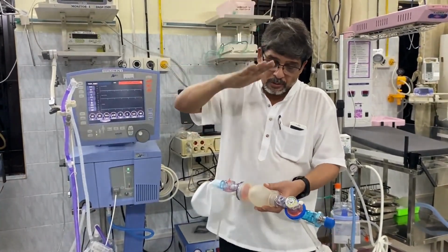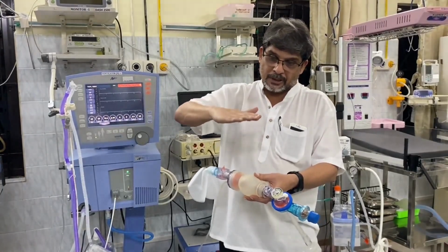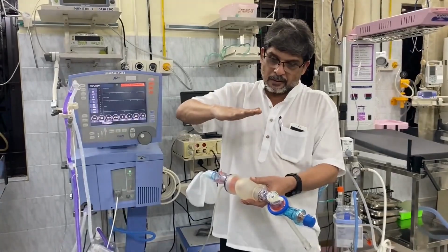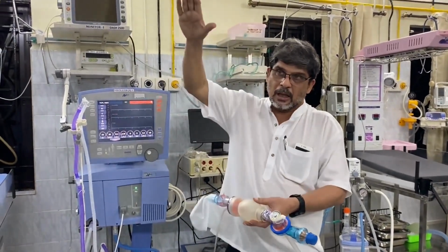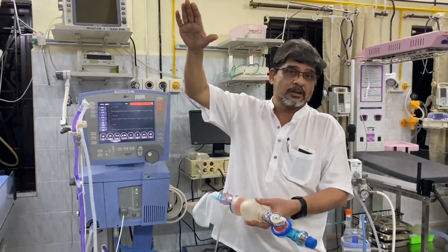Allow the lung to expire, breathe out. So breathe in, breathe out, breathe in, breathe out. Don't do it from here, breathing in again before breathing out. You will cause overinflation of the lungs.